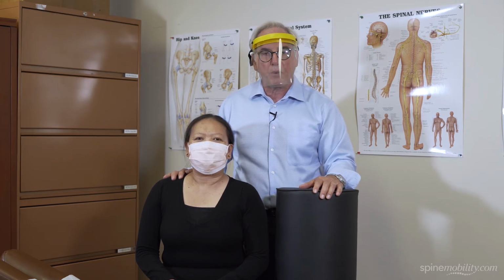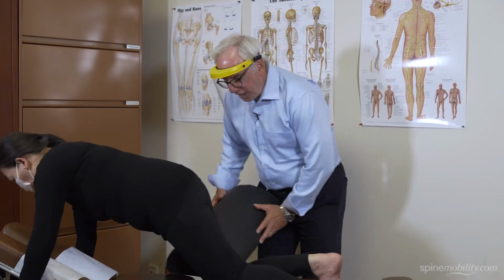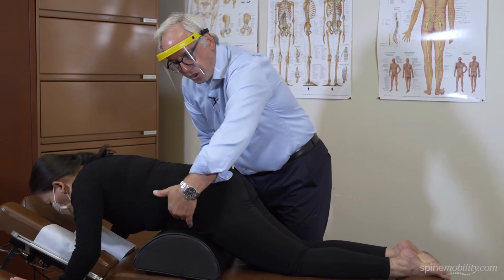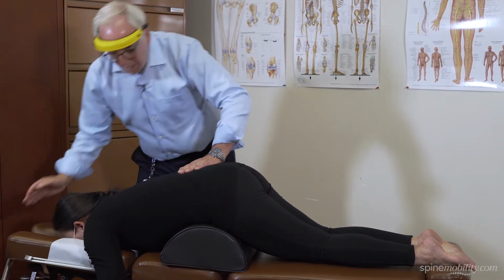Now we're going to demonstrate how to use the Spinemobility Bolster when implementing the treatment protocol for spinal stenosis and the persistent low back pain protocol. We're going to get Lilybeth on her stomach. The bolster is positioned on the table with the pelvis, specifically the ASIS, which are these 2 little bones, in the center of the bolster. And this goes down for supporting the head.